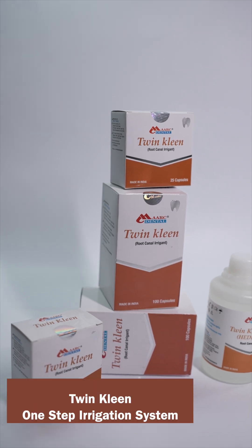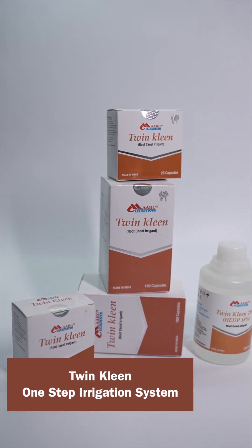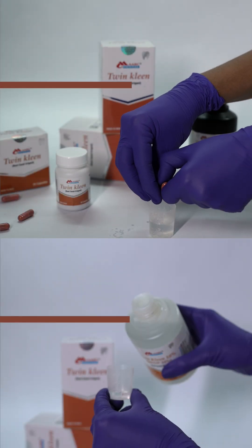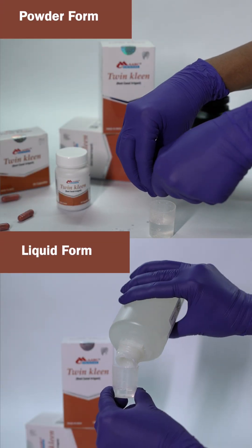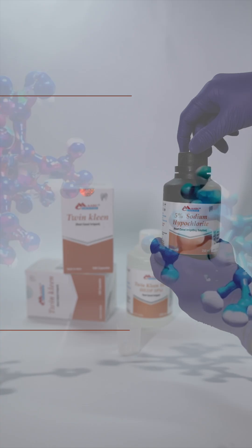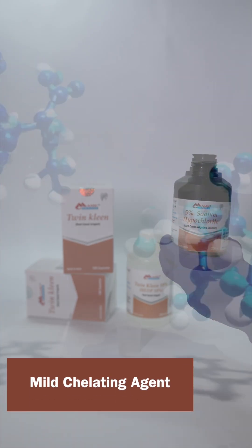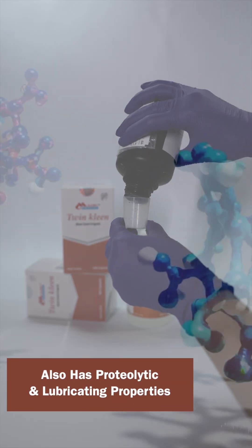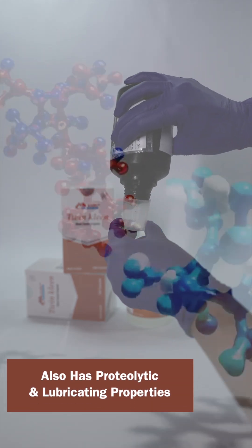Introducing TwinClean, the one-step irrigation system for predictable root canal outcomes. Available in convenient powder and liquid forms, TwinClean adapts to your preferred workflow. Formulated with ethydronic acid, TwinClean is a mild chelating agent with proteolytic and lubricating properties.